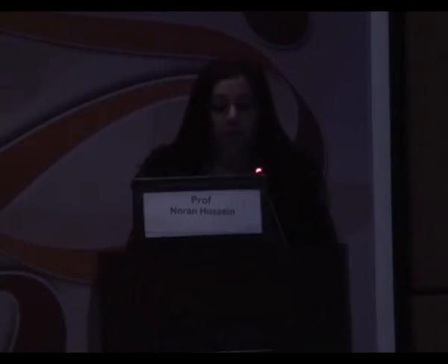So regarding the report, the radiologist must review the pulse sequences and the image contrast, the positioning and the anatomic coverage, the artifacts if they're present. He should revise the spatial and temporal resolution and the exam identification. The report itself must have, if there is an abnormality, it must specify if it is a mass, a focus, or a non-mass-like enhancement. We must also comment on the morphology and the kinetics, the size of the abnormality, give it a BI-RADS score, and give our management recommendations.